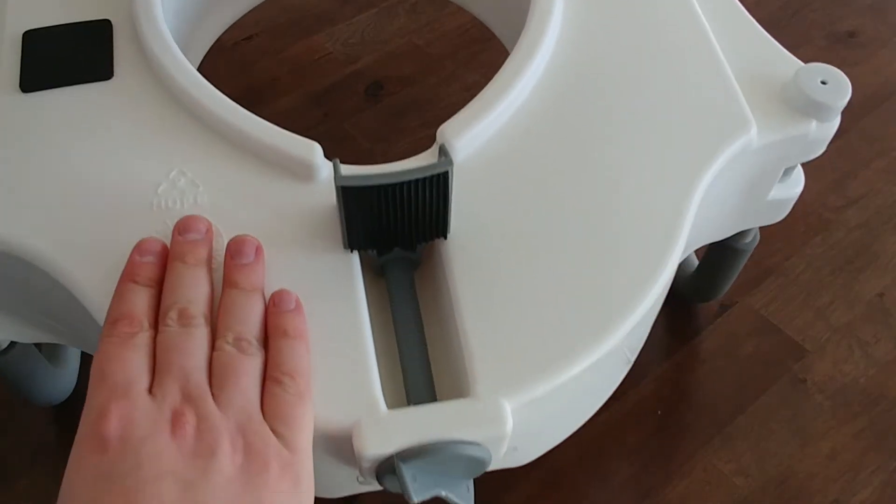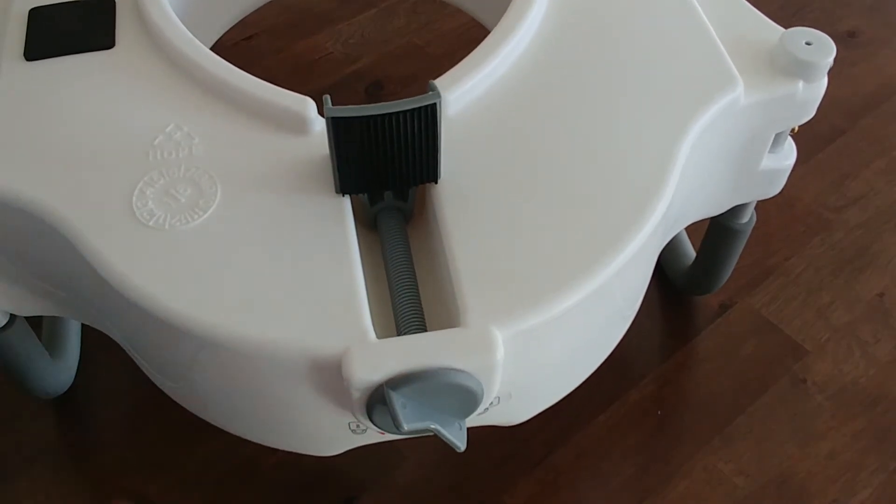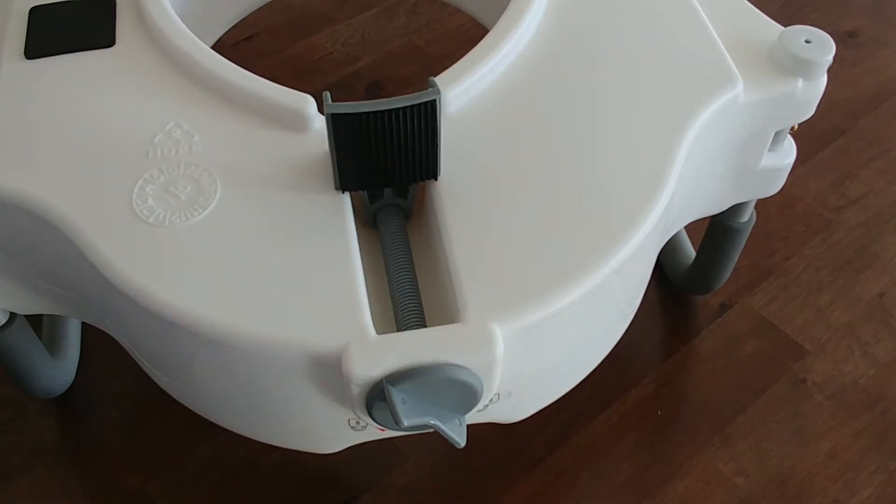Make sure it's on there well. Get that underneath the back lip first, loosen this up. Once it's in place, tighten it down and you should be all set.